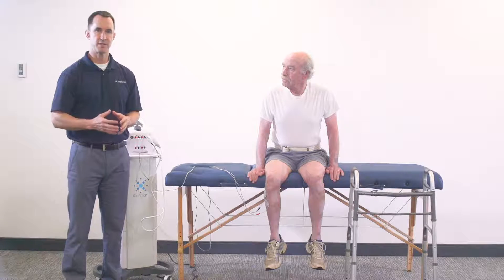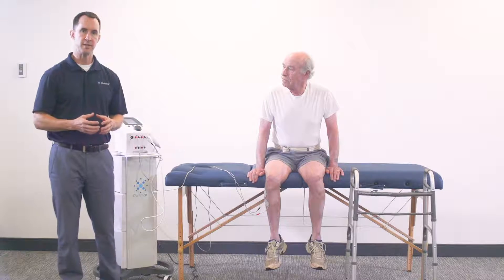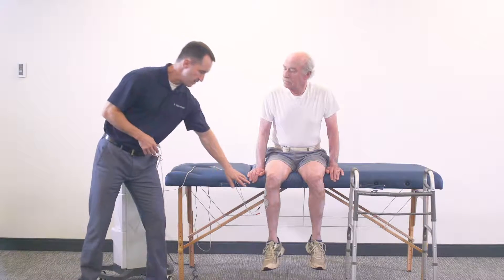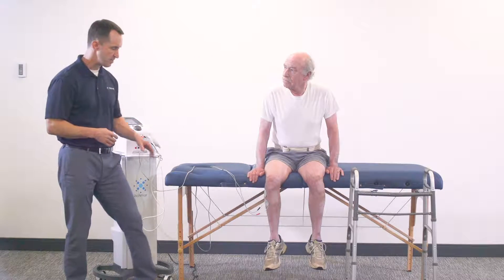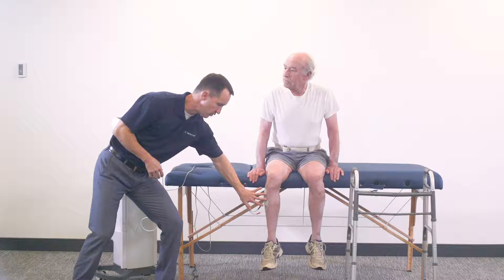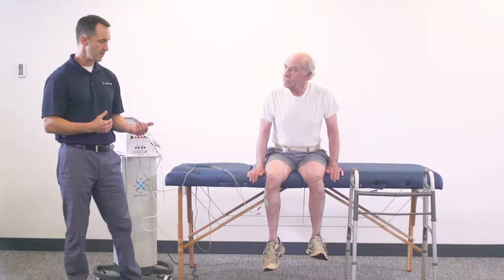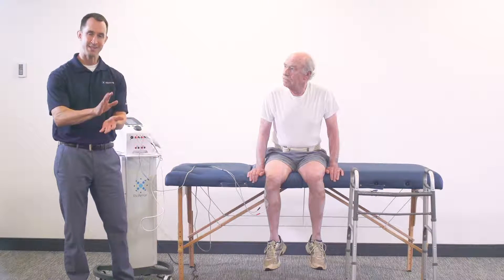Some clinical comments to consider: when placing the electrodes on the muscle belly of the anterior tibialis, you may find yourself having to pause the unit once or twice to ensure proper placement of the electrode in order to get proper dorsiflexion. Right now, we have them placed on the peroneal nerve and then just a little bit further down from there — this is how we found to get the best dorsiflexion with our patient.